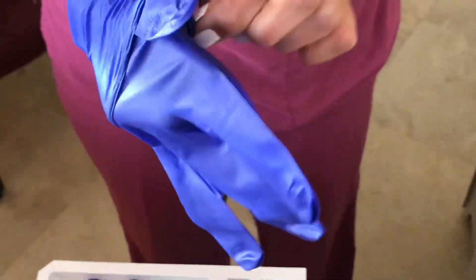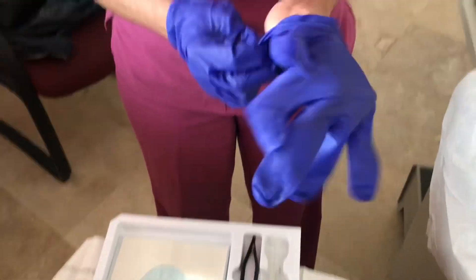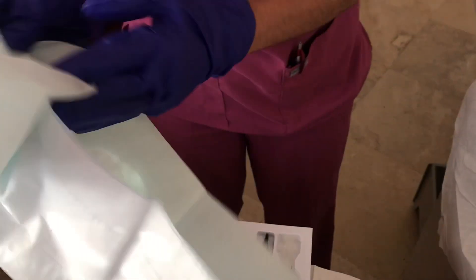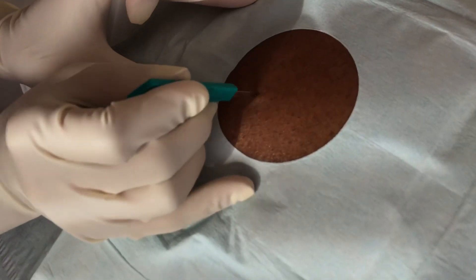I then switch over to sterile gloves and grab the fenestrated drape and place it over the patient. In this case I had to change my blue sterile gloves that came with the tray to my regular gloves because they were too big.